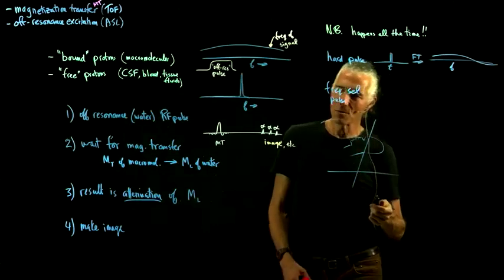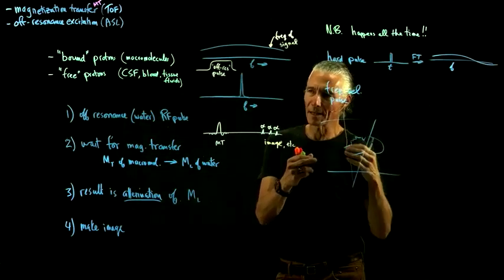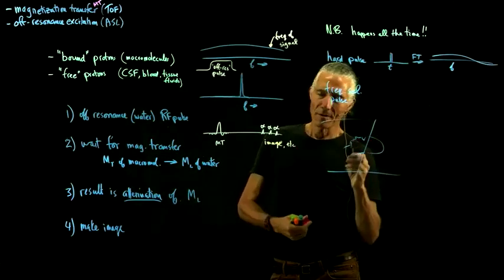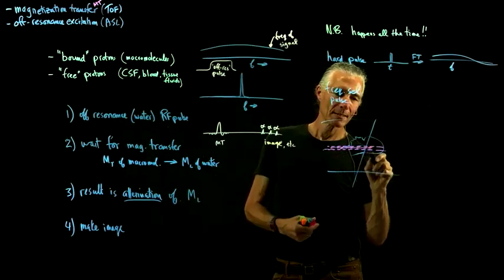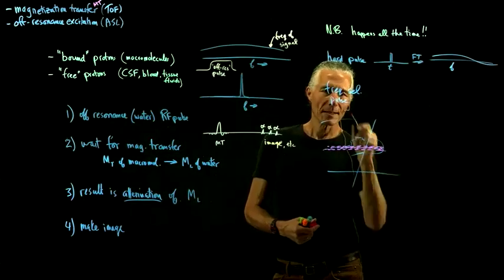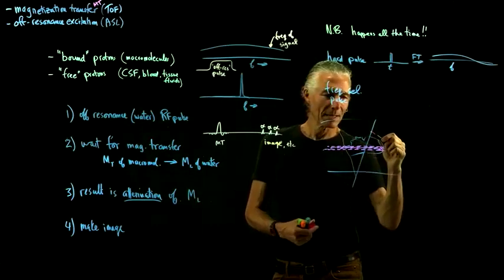And how does it do that in the Y direction? It changes the Z component as you move in the Y direction. And why are we turning that gradient on? Because we're trying to select a slice like this that has just the resonant frequency that the pulse has, so that the pulse will select that slice. Well, what about the guys over here?